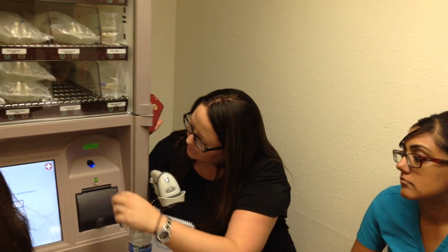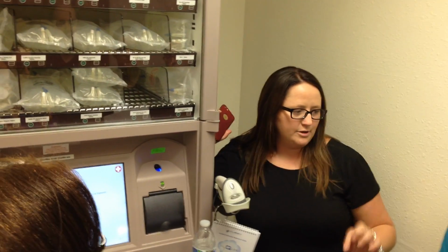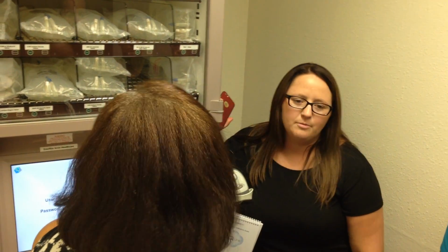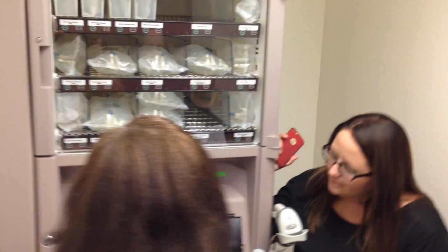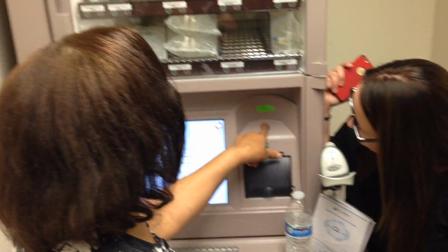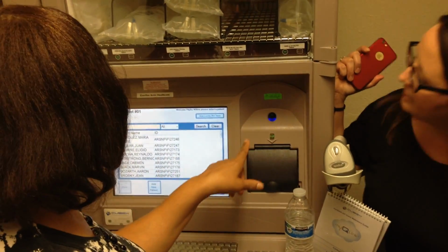When you get to the cabinet, after you've sent all the orders, you'll want to fingerprint in. You do not have a username or password. So go ahead and fingerprint in. Also remember what finger you used. Same when you walk in. One more time. It'll turn red as it's going. Yep, this one's red. Perfect.